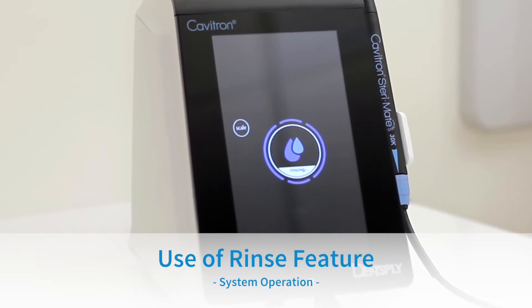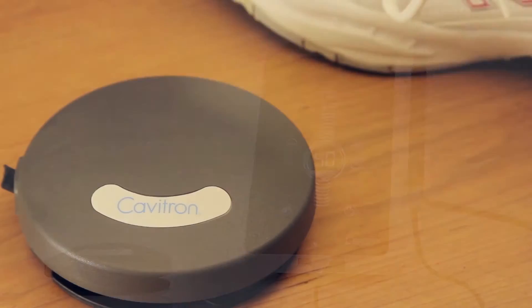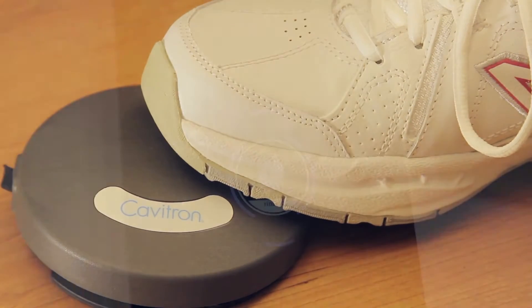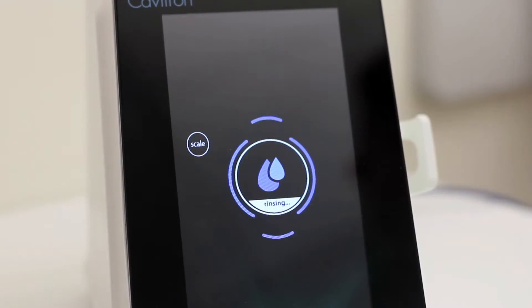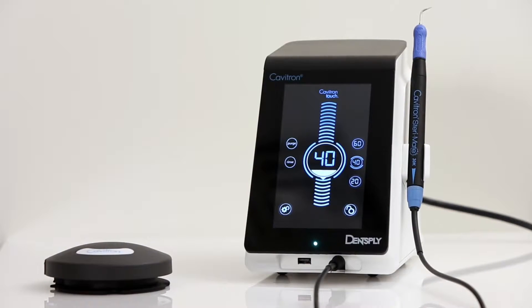Use of Rinse Feature: Users will operate this feature during an ultrasonic scaling procedure when lavage is desired with no cavitation. To use, press and hold the foot pedal for rinse mode cycle. To exit Rinse Mode, press the scale button to return to the main screen.